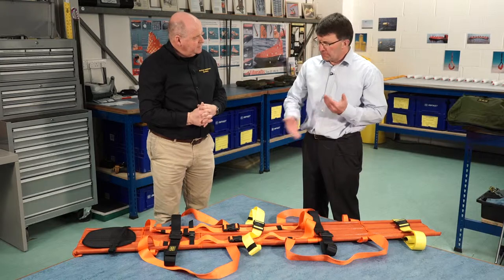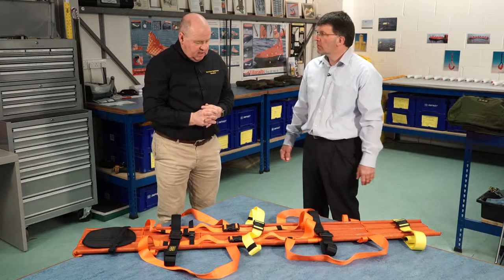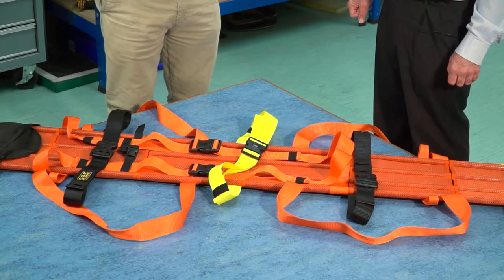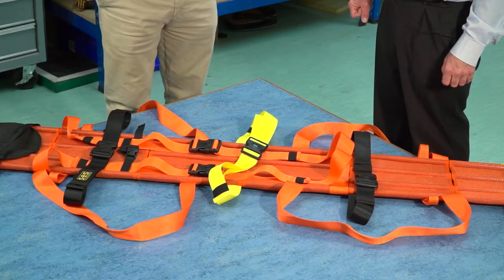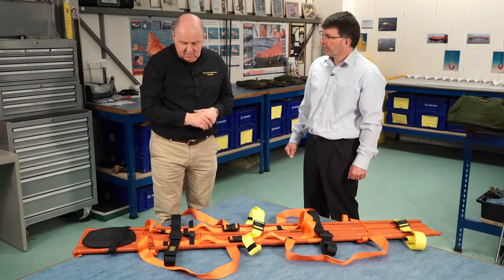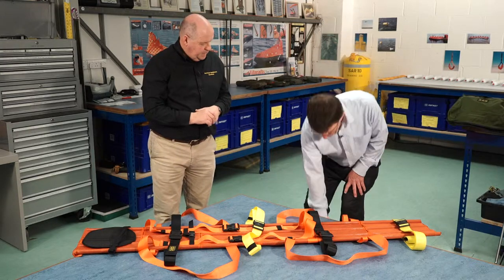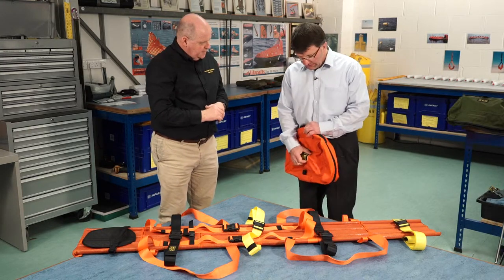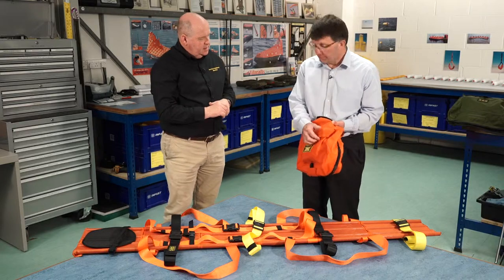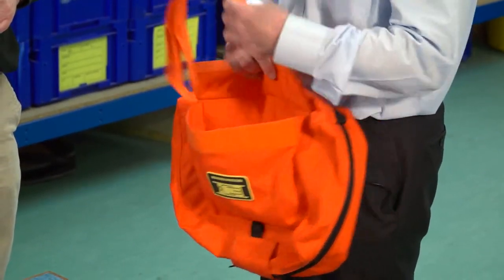Now tell me about maintenance — is there any maintenance to do on it or is it fairly maintenance-free? It's fairly maintenance-free. We've tested it with all sorts of known chemical cleaning agents used in the health industry, so all those are applicable. It can be power washed. The only thing we really do is make sure that the rods are kept clean and dry. I noticed the bag has a little pocket in the front with another strap in it — could you tell me what that's for?